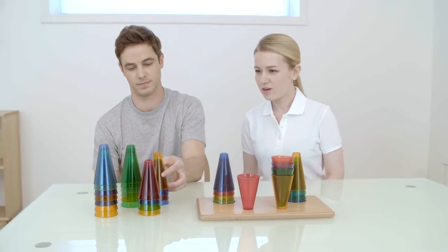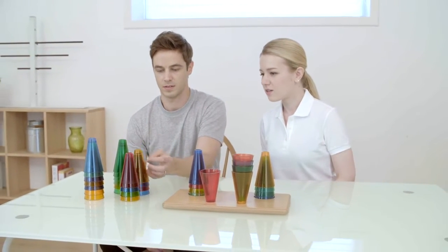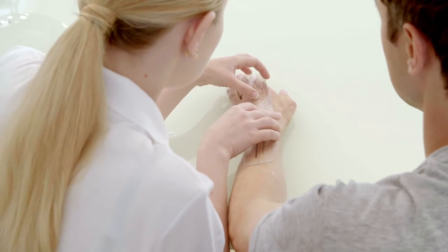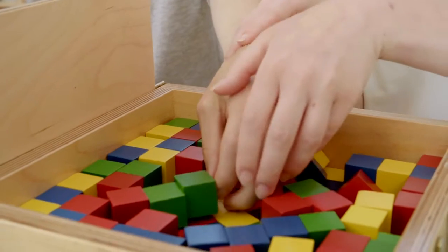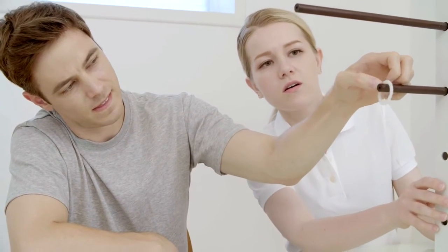Rehabilitation therapy is a long journey and is a challenge to mind, body and spirit. Exercises that repeat every day. Although endlessly reiterating simple exercises for a better future, it is doubtful if improvement is being made. Having lost the attitude when the rehabilitation exercise started, for whom and for what am I repeating these exercises? Aren't you getting tired because of such questions?